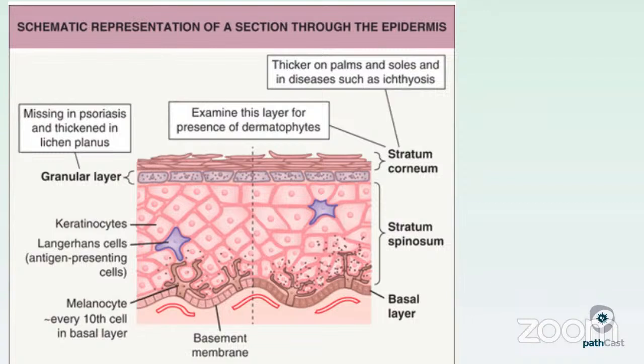The basement membrane zone represents the junction between the epidermis and the dermis. And this in and of itself is a quite complex structure, as you'll learn more in detail when you get to the immunobullous disorders, where this is a target of some disease states.